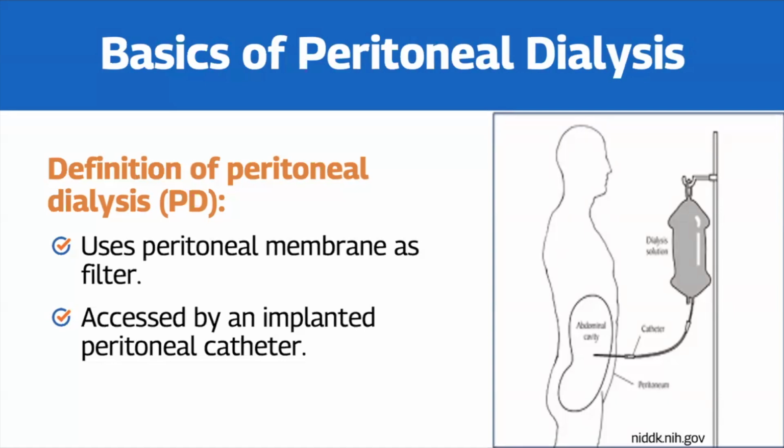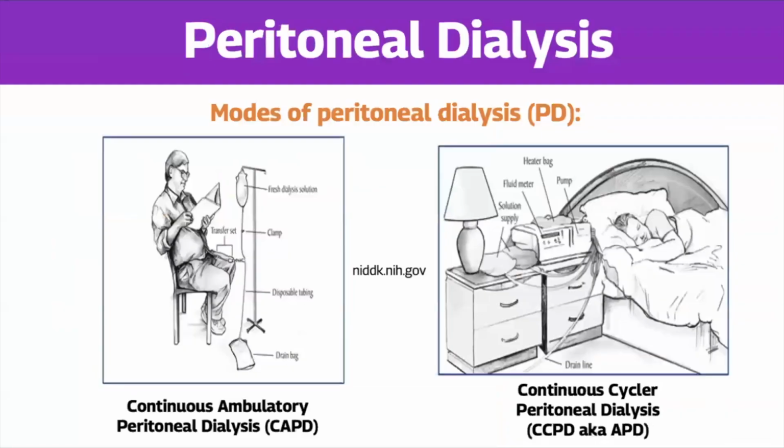day. So during the draining process, we would connect the drain bag and let the patient drain and then refill with fresh solution. So it's really a flushing of their belly, and it does take out the uremic toxins and fluid.